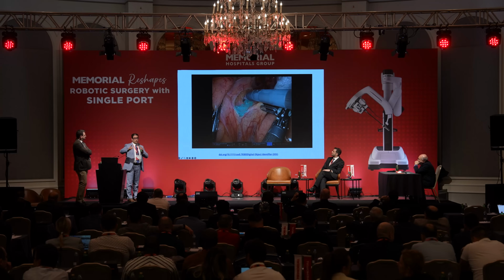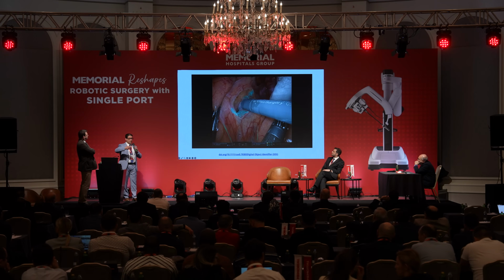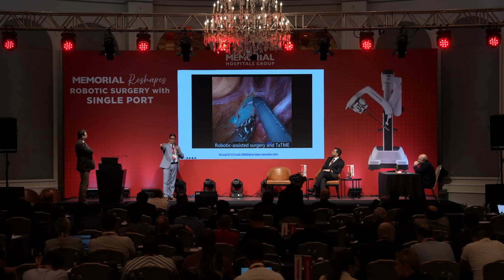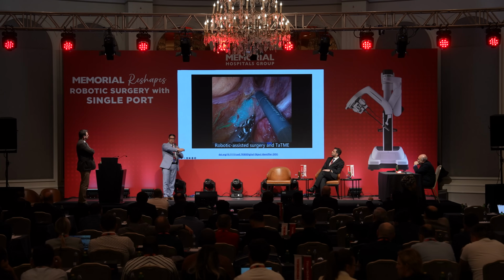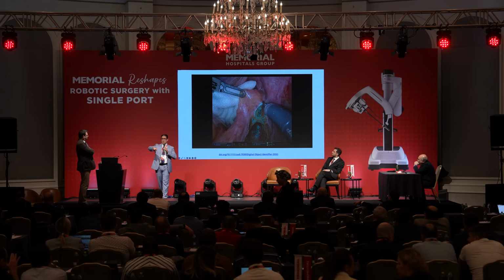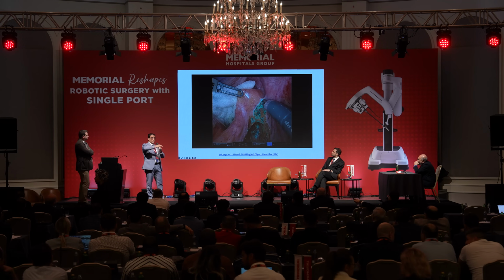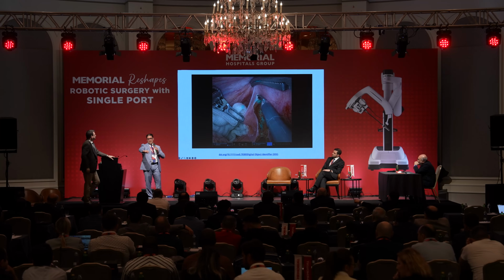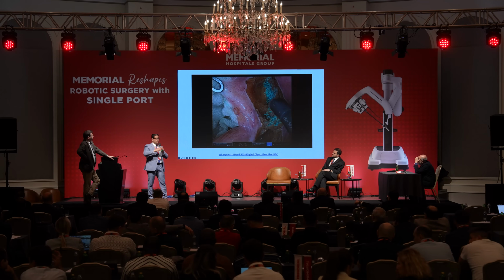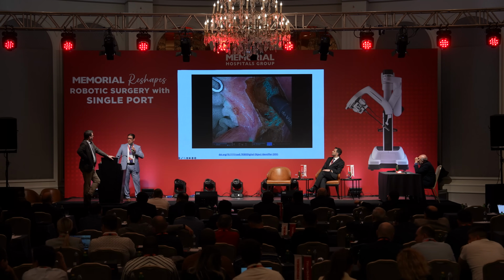This is what I was referring to as different in how to drive the instrument. This is basically a straight instrument with a 3D tip, and you can do a straight line the way you want without any problem. So the transition from laparoscopy to this was actually an upgrade, because they use the same instrument that you are used to with a better version of the tip that can go three different ways.